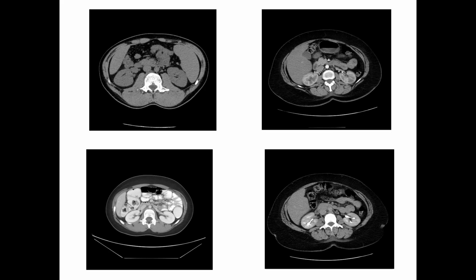So any tumor inside the collecting system, like transitional cell carcinoma, or a stone inside the ureter, you'll see that giving you a filling defect inside the collecting system. So we'll see this in the next coming lecture, inshallah. We'll see more examples of this.